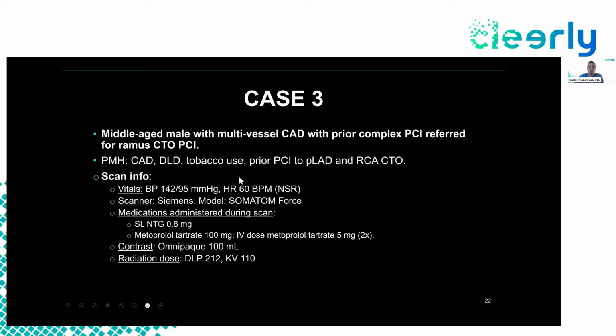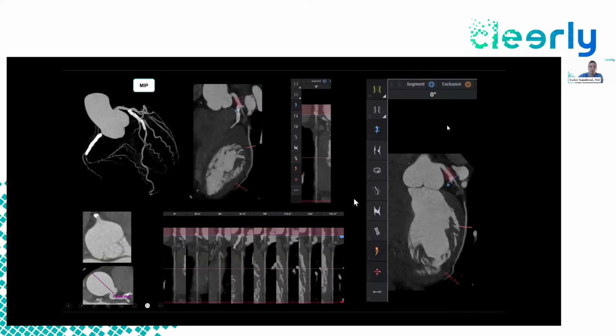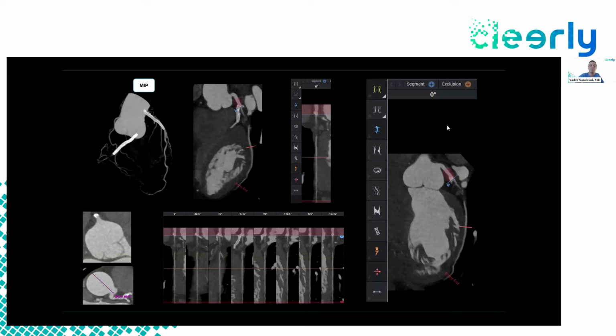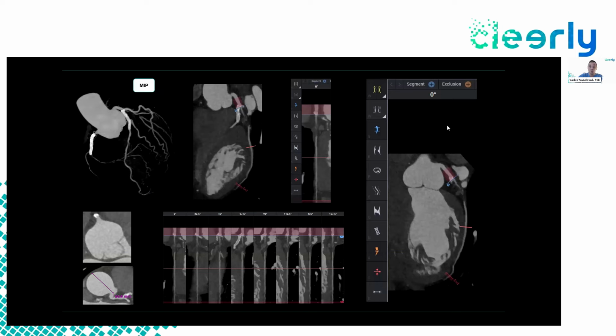Last, to wrap it up, an important tool that we're also increasingly understanding from CT, and actually it's one of the few areas in interventional where there's a randomized trial of CT-guided PCI in patients with CTO, with data showing that a CT-guided PCI approach in CTOs improves CTO PCI success. So there are opportunities for us to better understand how to use CT for CTO, again, by better understanding the complexity of these lesions before you come to the cath lab.